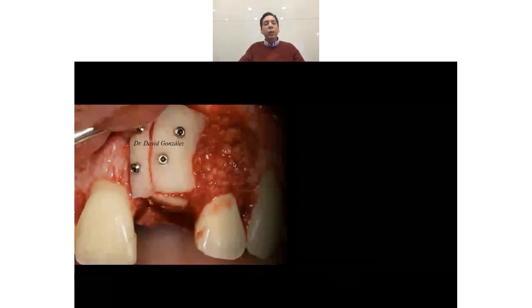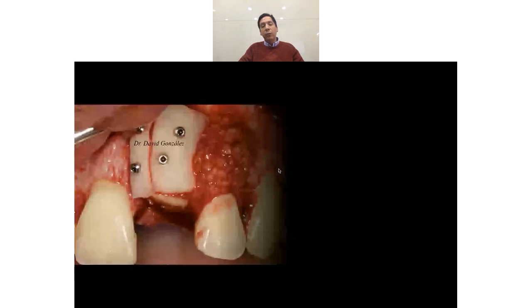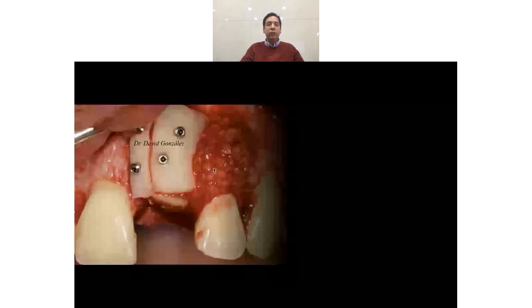So now my question as a periodontist is, do I have to place a membrane if I want to cover the root with bone? I didn't do it because even though I place a collagen membrane there, it's not predictable. But I also have the theory, I will go back one slide, that this bone block will act as a tent pole and will prevent the collapse of the flap over the root. But it was a hypothesis. So I didn't place any membrane.